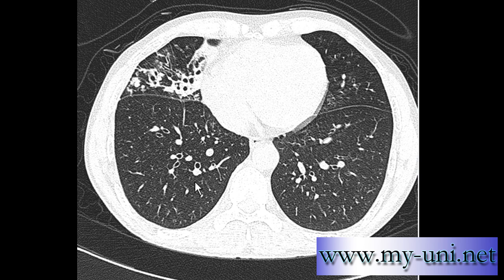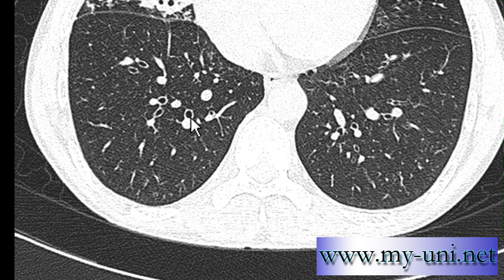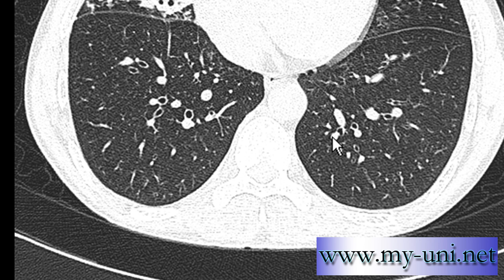The answer is quite simple. Vessels running parallel to bronchi are pulmonary arteries — they run in a bronchovascular bundle. So this is a bronchus and this is a branch of pulmonary artery. This is a bronchus and this is a branch of pulmonary artery. This vessel here is more likely to be a pulmonary vein, and this one is a pulmonary artery.